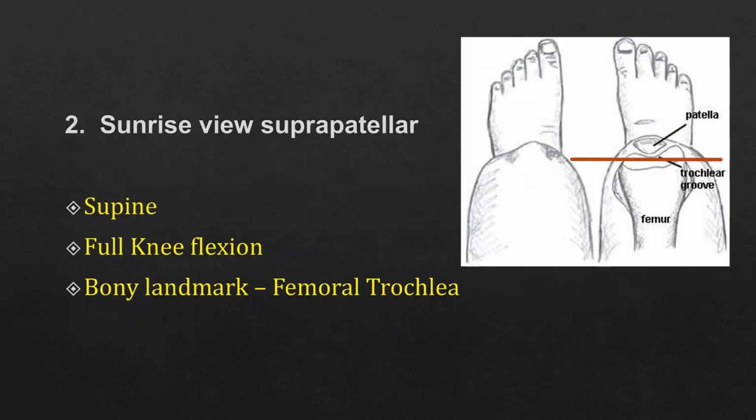Now the second one is when you do the sunrise view of the suprapatellar region, the patient is supine and you ask the patient to do full knee flexion.